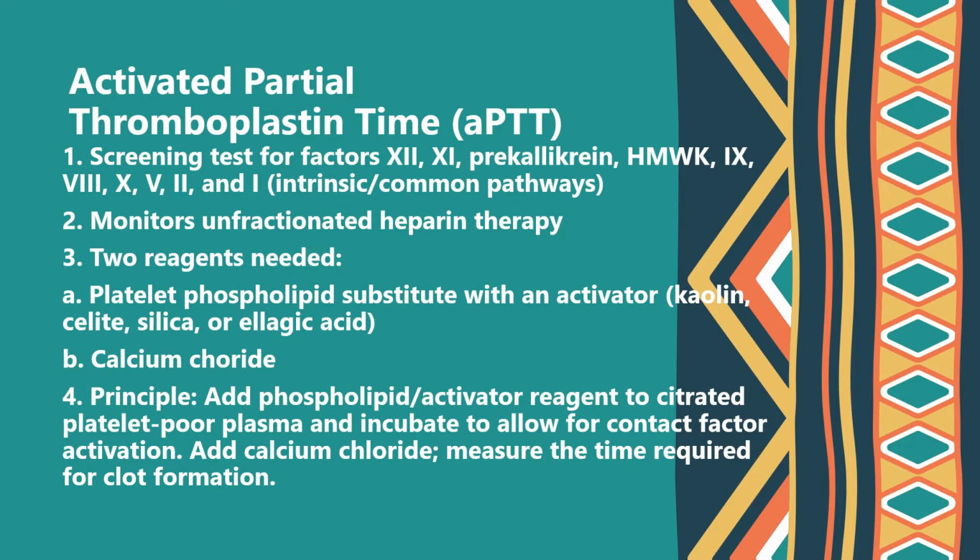There are two reagents that are used here. One is platelet phospholipid substitute containing an activator, which can be any of the following: kaolin, celite, silica, or ellagic acid. And the second one is calcium chloride.